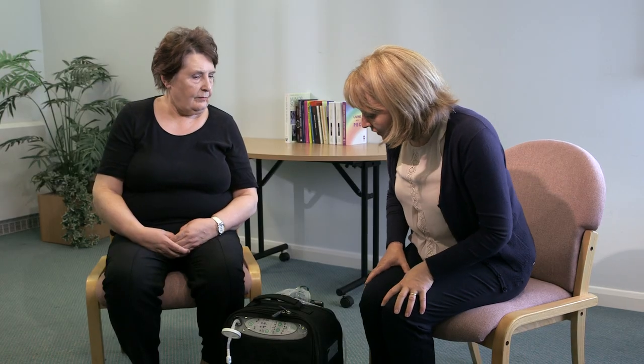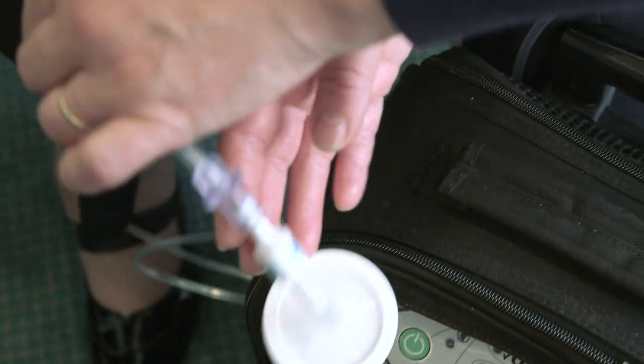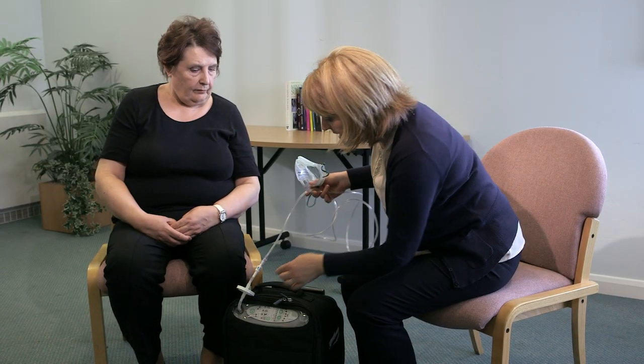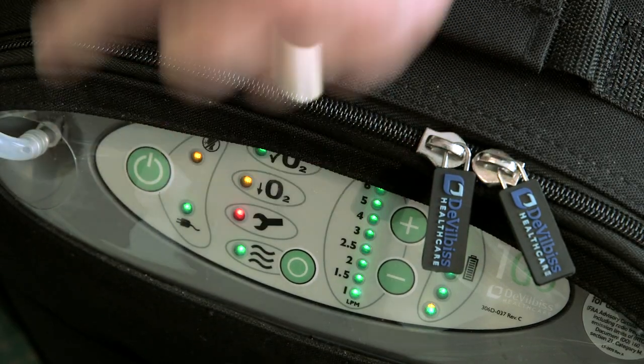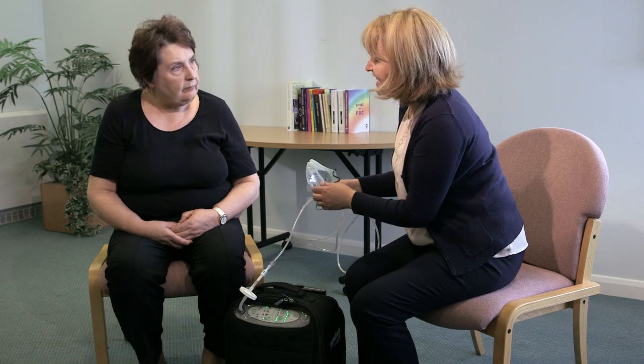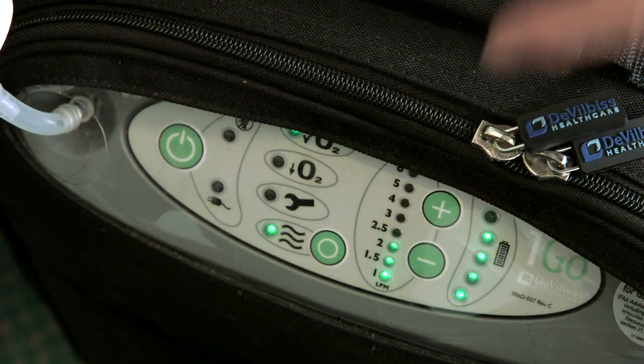Catherine, it's time for your oxygen again. You've got your oxygen concentrator here, and we've got the fire brake on and the tubing in your mask — it's all set to go, so we'll just switch it on. All the lights are green, so the oxygen's ready to use. We'll just check the flow rate — the doctor said two litres per minute.